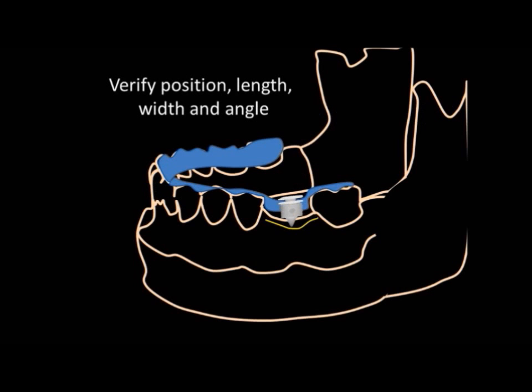Place the guide in the patient's mouth. Take the correct size verification point and push it through the metal sleeve so that it penetrates the gingiva and makes contact with the bone. Now take an X-ray with that new assembly and look at the direction that the point is aiming at. That will show you the direction that the implant drill is going to follow.